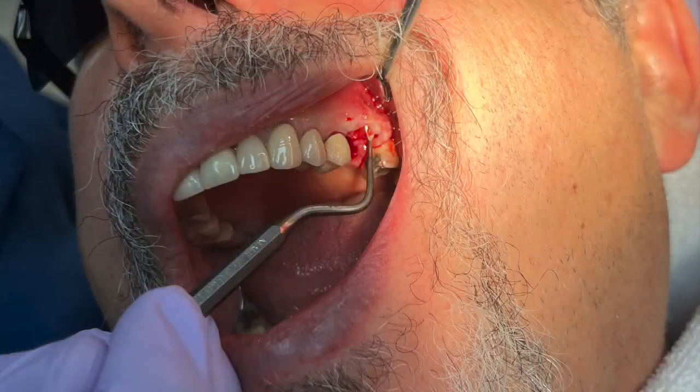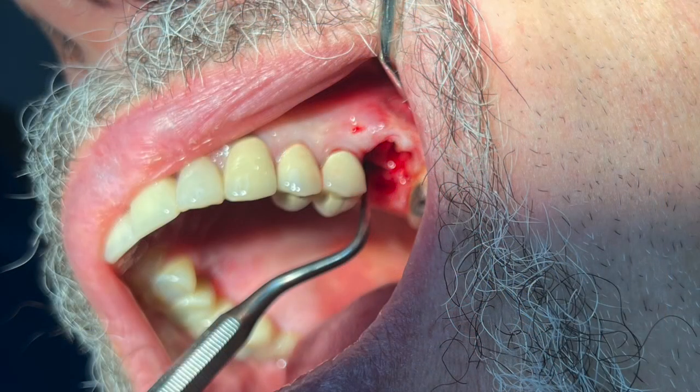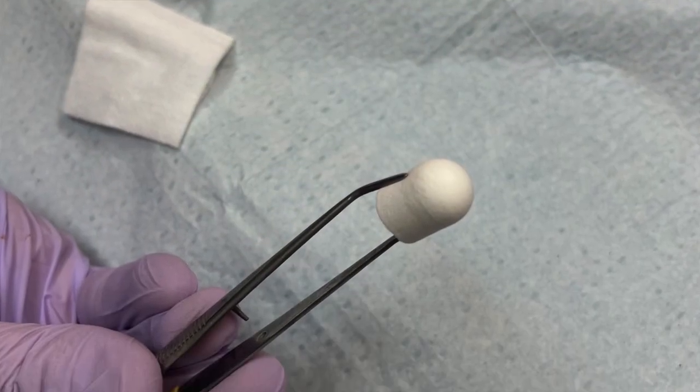We are then going to curette any infected area and evaluate the facial plate, removing any granulation.